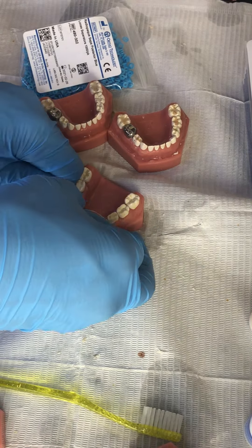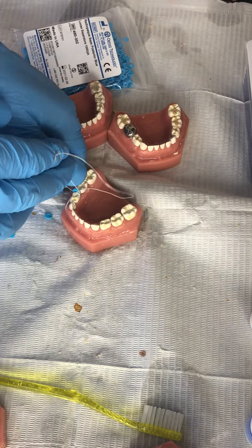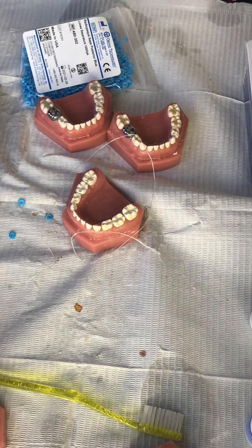There we go. It's a little harder on an ivory tooth. And then you can fit your stainless steel crown.